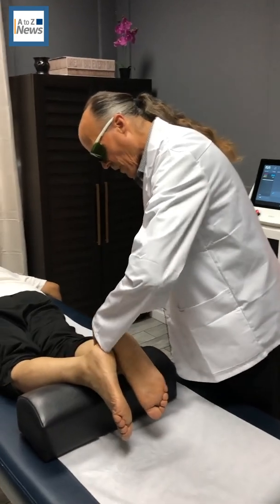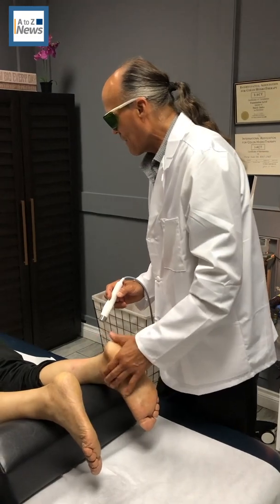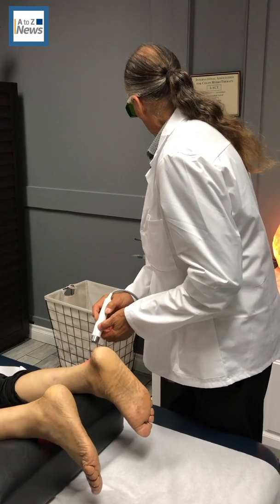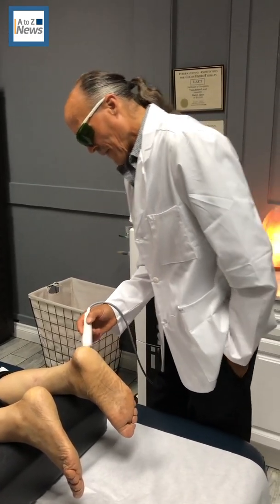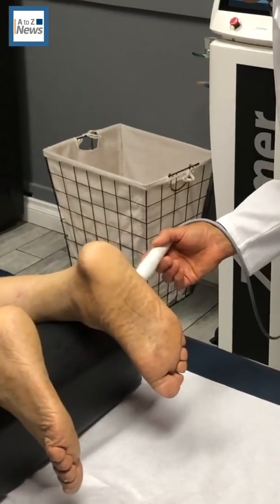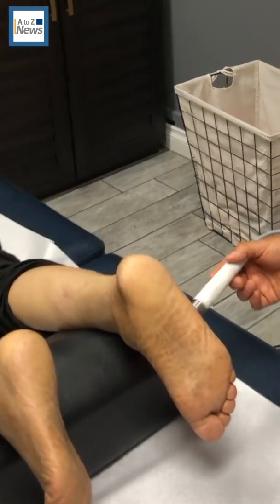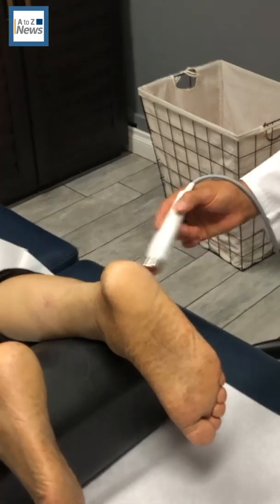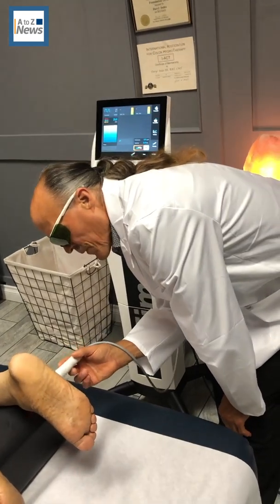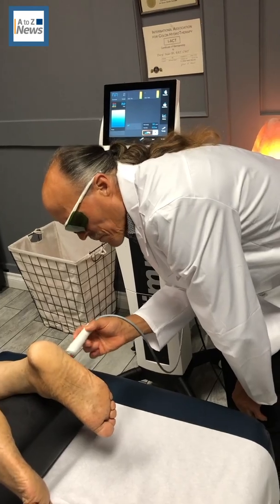We're going to go ahead and get him started. He had a sprain — turned his ankle. We're keeping it in circular motion so we don't heat the skin too much, causing a problem for the patient. It's easier without the spacer on an ankle like this where it's more bony.